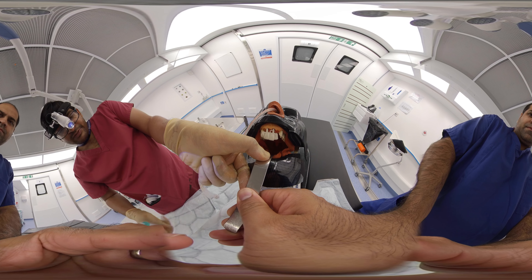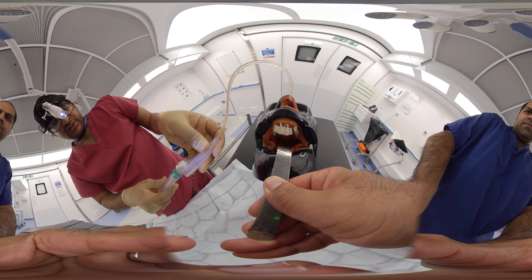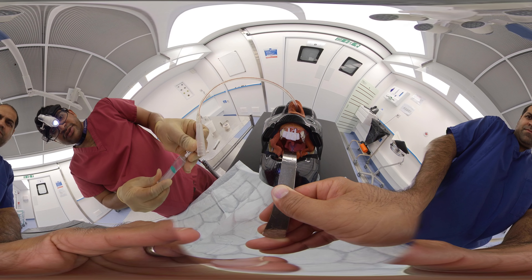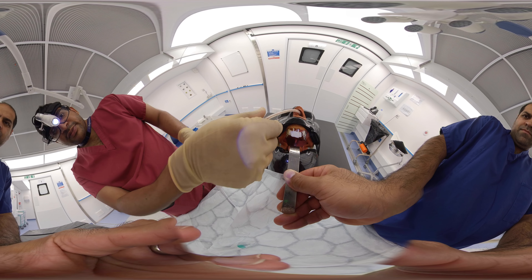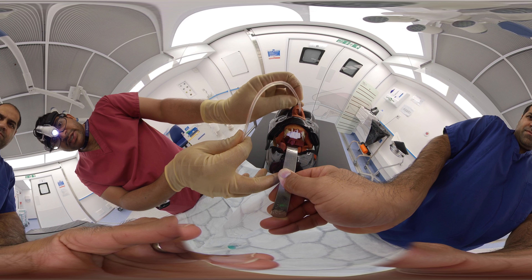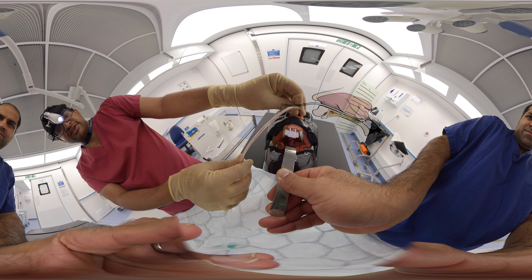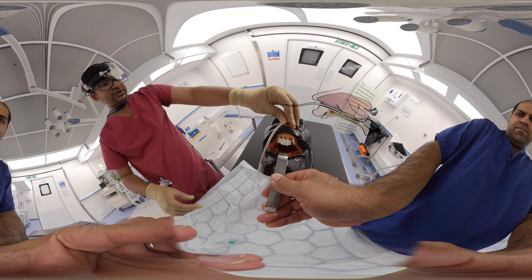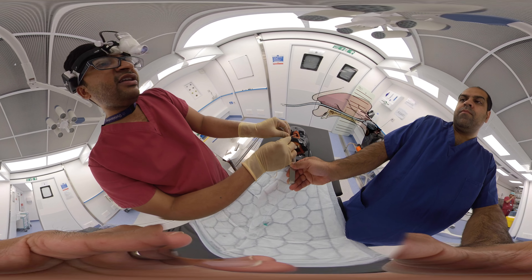In this case there is more tension, so I'm reducing a little bit of air so that it goes into the post-nasal space. I'm pulling it up again until it goes into the post-nasal space and we leave it there, also watching the uvula for blanching.